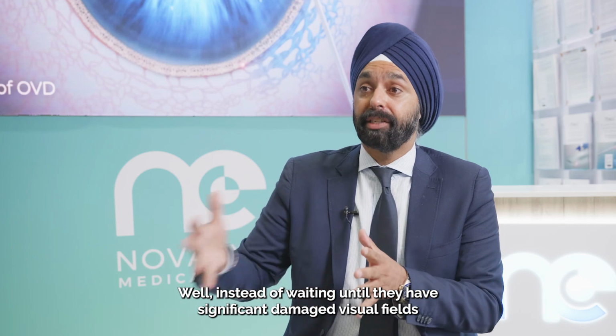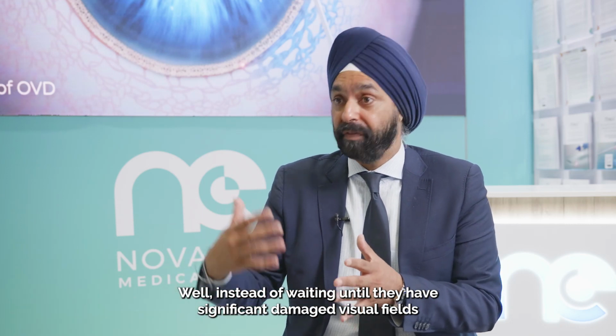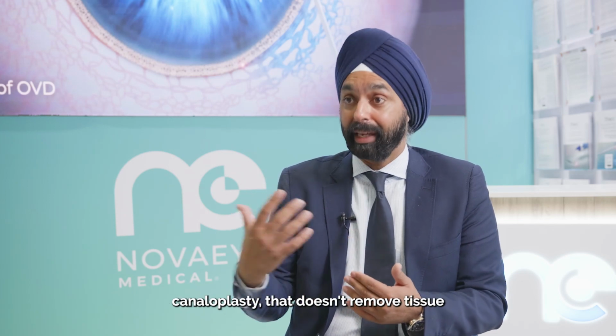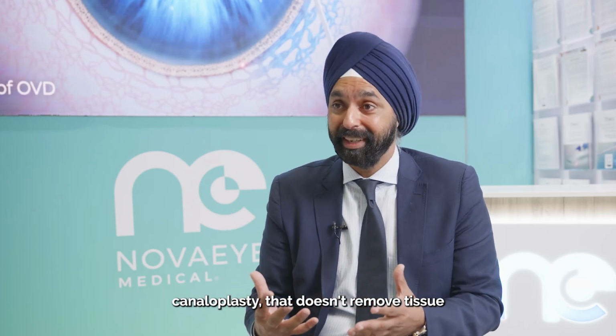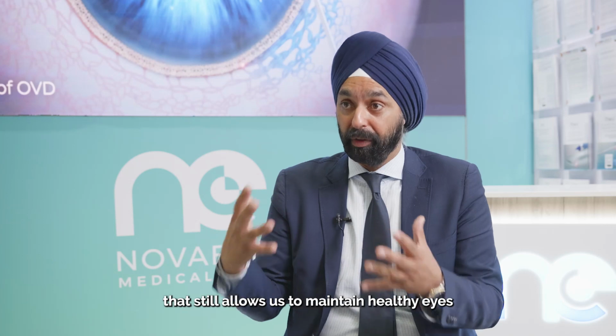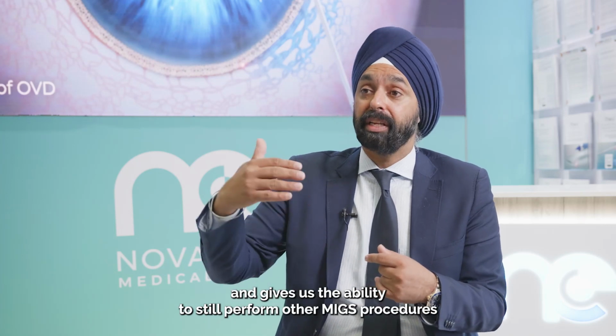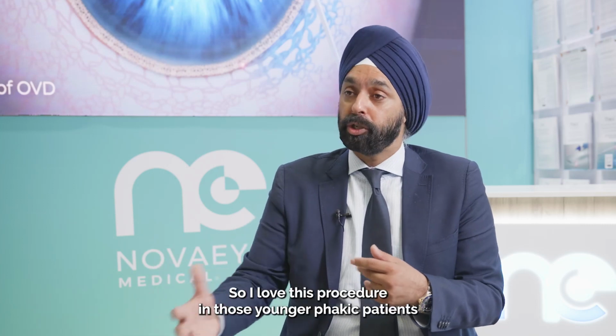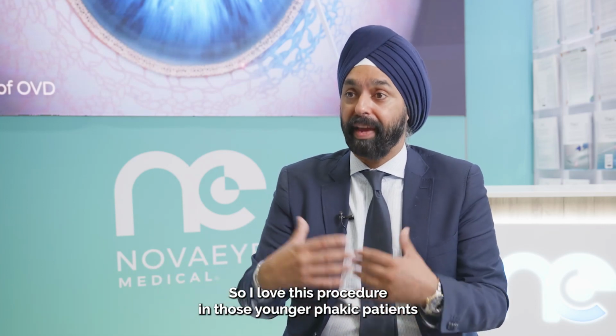Well, instead of waiting until they have significant damage, visual fields or optic nerve damage, let's go ahead and say, let's do a safe procedure, canaloplasty, that doesn't remove tissue, that still allows us to maintain healthy eyes, and gives us the ability to still perform other MIGS procedures later on when they develop a cataract. So I love this procedure in those younger phakic patients.